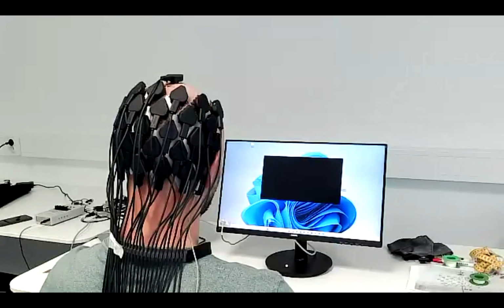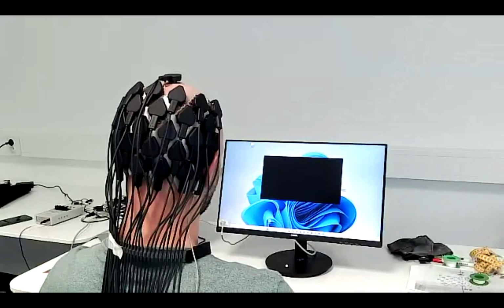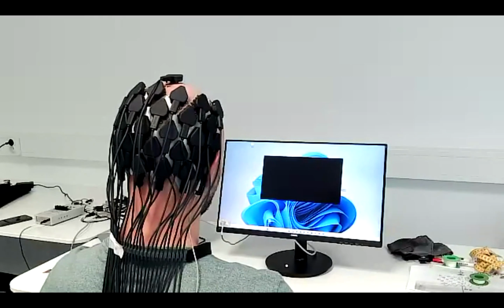presentation at the Ars Electronica Festival with the g.PANGOLIN system, where we covered the whole scalp and we used 4 g.HIAMPs. So in total we covered 1024 channels on the scalp. And yeah, this was quite some effort to set up, but for our experiments, we now try to reduce the setup effort and cover special regions for the locations that we're interested in.